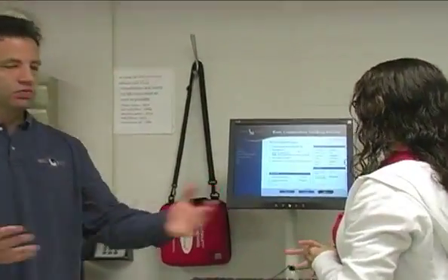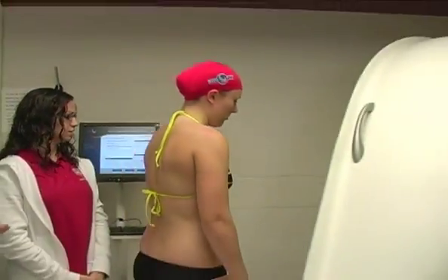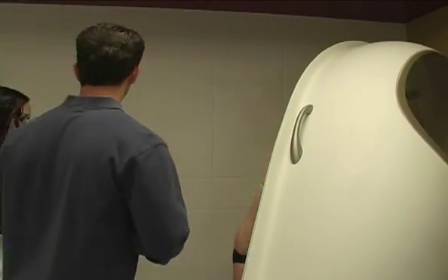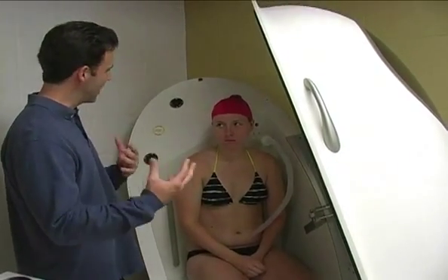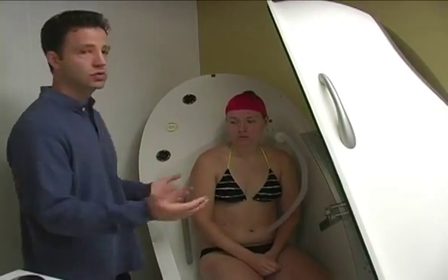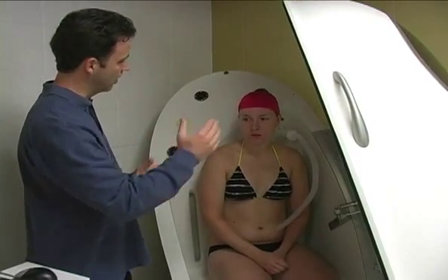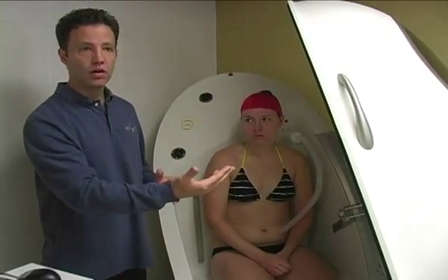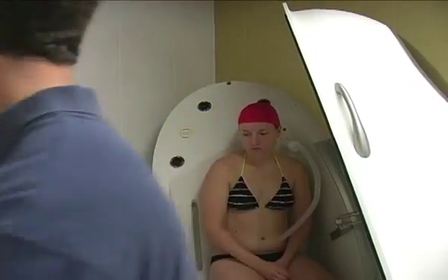So now is when you're going to enter the chamber. So I typically, if you could enter the chamber here, Brittany, I tell her what she can expect. So if you can sit down, please. We're going to do 2 or 3 measurements. You'll hear some pops and clicks. Those are the valves opening and closing while you're inside the BOD pod. What I need you to do is just relax. Just sit how you're sitting now, hands in your lap, breathe normal. You don't want the subject talking or joking around with somebody in the lab. Some people close their eyes. It will be 50 seconds. Okay, I'll close the door, 50 seconds. Then I'll open the door, and then we'll do an additional test. Okay? Any questions?